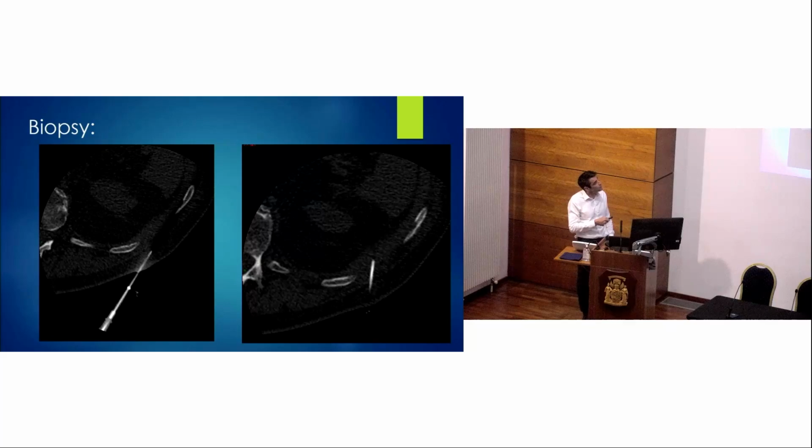So this is again a bone window, so it's hard to see the tumour. The tumour is in here between these bright white bits, which are the ribs. And this is my needle, which we have scanned. And you can see it's not quite pointing in the right direction yet. There's a tumour there. I'm pointing off here. But then with an adjustment, you can see the tip of the needle now lying within that tumour bulk there. And we can then fire a gun into that and take a bunch of samples, and hopefully that gets us the tissue that we need to make the diagnosis.